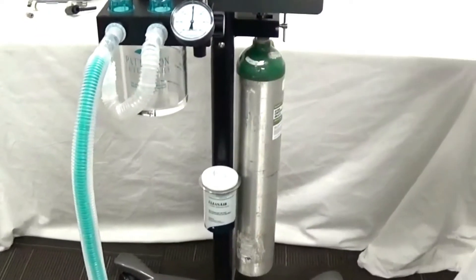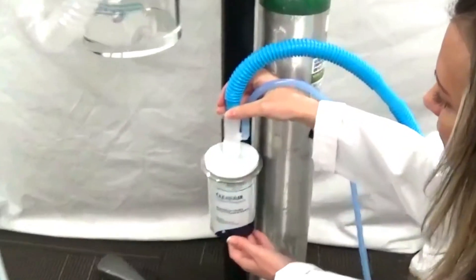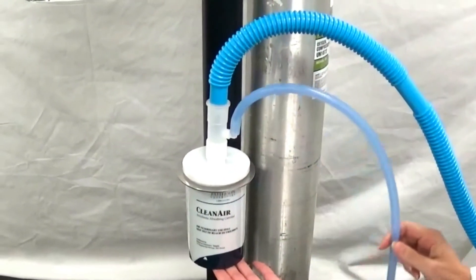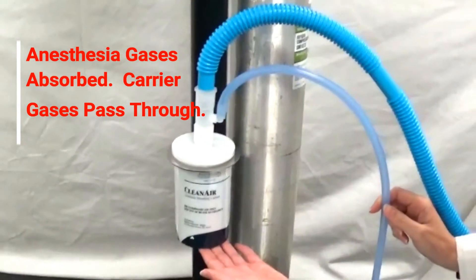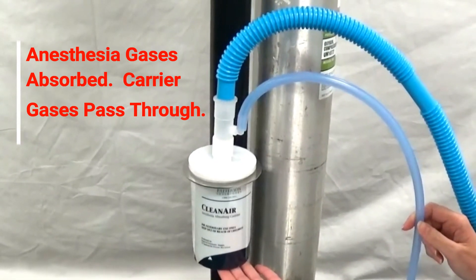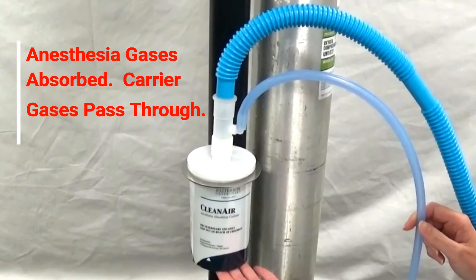First, we will attach the Reichen gas scavenging kit to the clean air canister as shown. It is important to note that the canister should either be suspended or laid on its side so that the gases that are not absorbed can flow through the bottom portion of the canister.